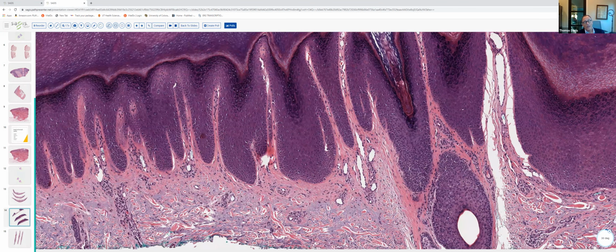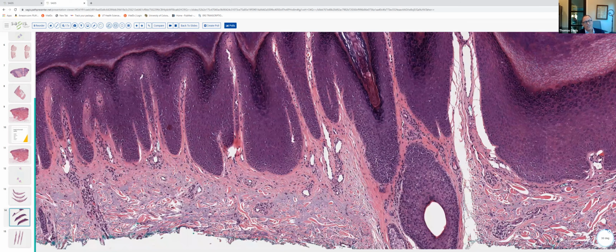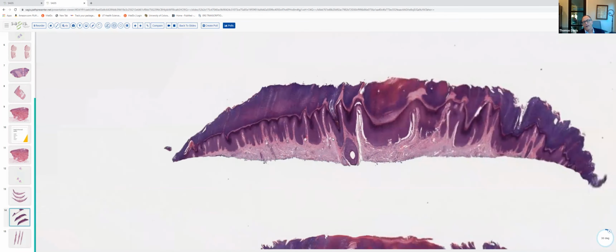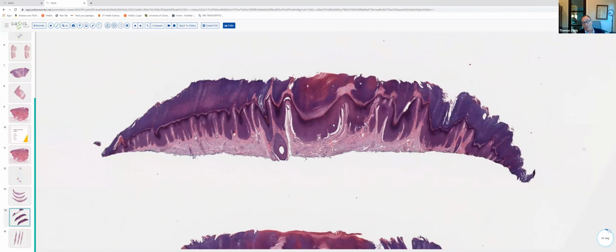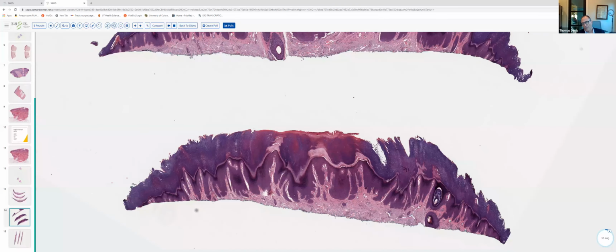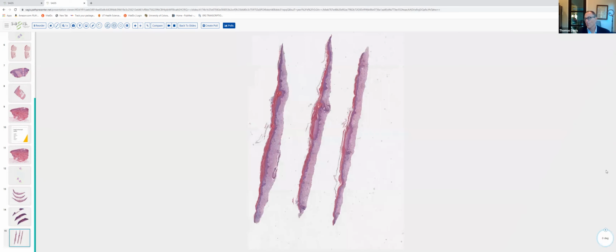And in this particular instance, as we commonly see in LSC, there's not much in the way of an inflammatory infiltrate. Usually the condition that triggered LSC, if there was an antecedent condition, is long gone by the time the lesions are biopsied. So again, another example of a psoriasiform dermatitis. And we'll close out our discussion of psoriasiform dermatitis with slide number 10.